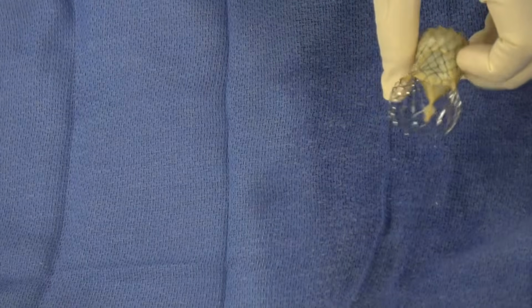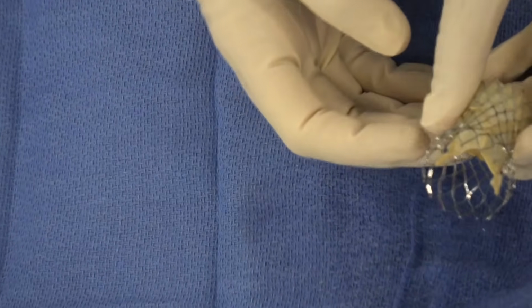There are 3 posts here. You see there where the valve is attached. So, if your left main is in front of this post. Anu, hold on one second. Okay, better now. Go ahead. Okay, you can see better. Yes, much better. Okay, thank you.